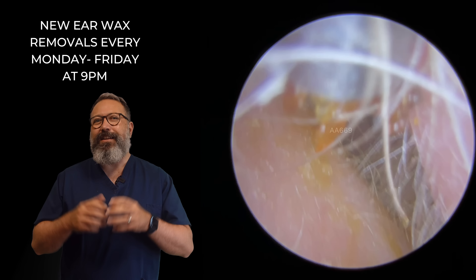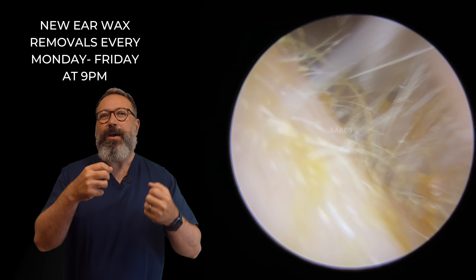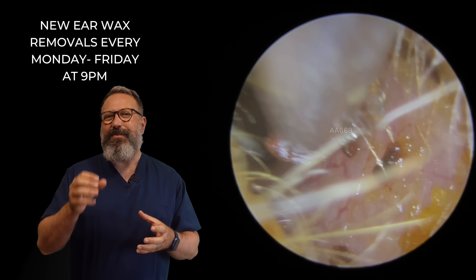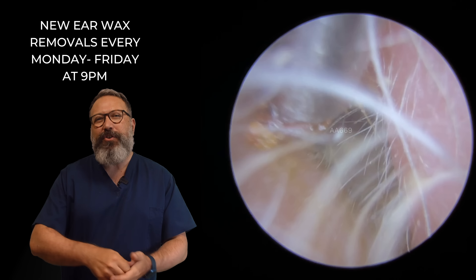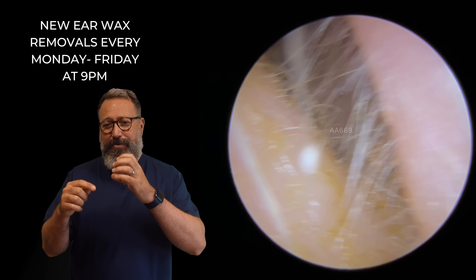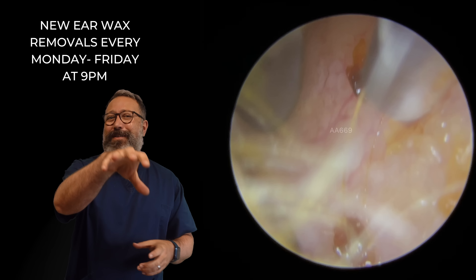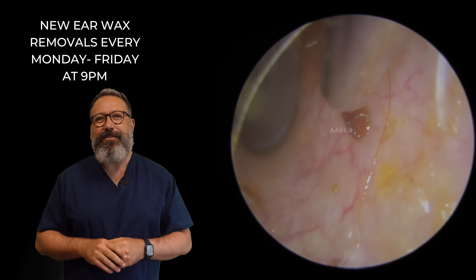Now if this was just that little bit softer, what we'd do is pop onto those little pieces and a lot of that would just get sucked straight inside the tube. But because they are that little bit harder, they're blocking the entrance to the tube. Sometimes you might — what's the best way to describe it? If you've ever tried to hoover something up off the floor, and the end of the pipe gets something long and thin crossed across the end, you can still hoover but the bits get stuck in the end. That's a bit like what it's like here. So we're just going to take these little loose bits off the edge there.